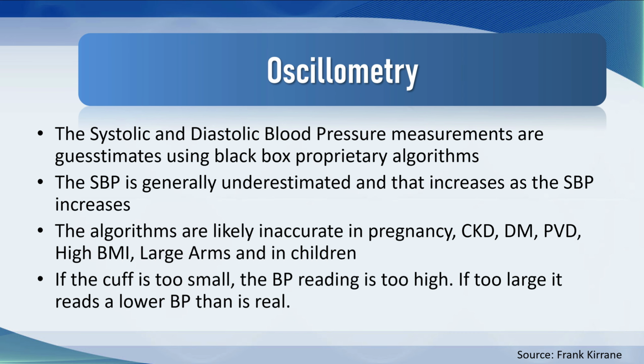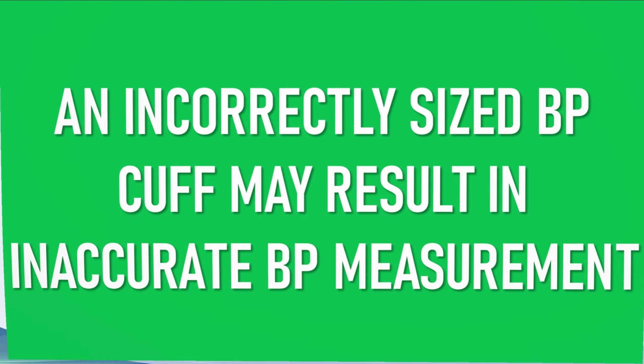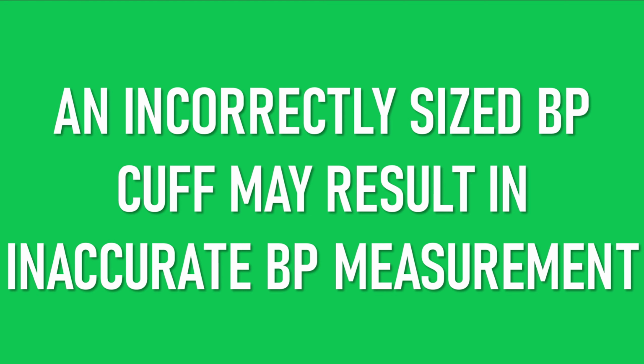Just to reiterate that point, an incorrectly sized blood pressure cuff may result in inaccurate blood pressure measurement. If the blood pressure is lower than one would expect, make sure that the cuff is not too big for the arm or the leg.